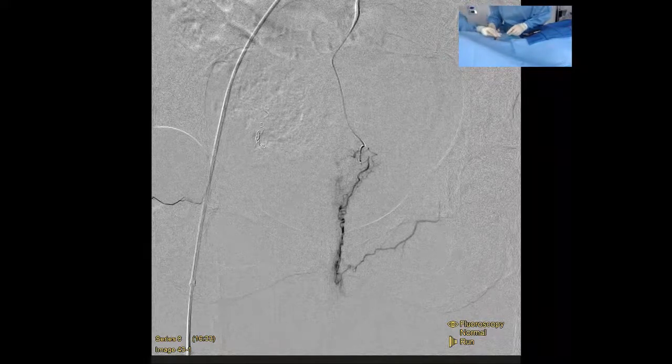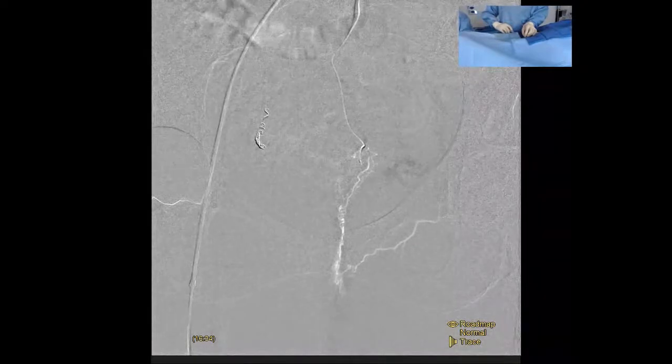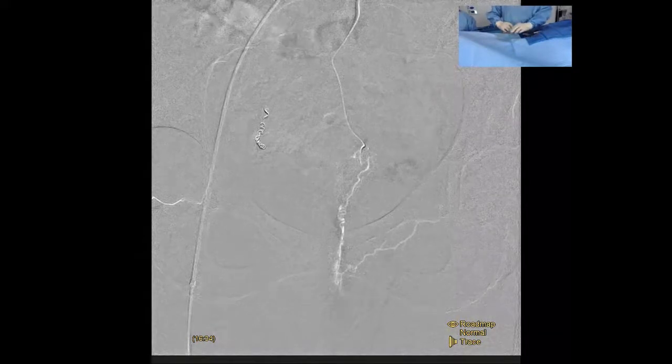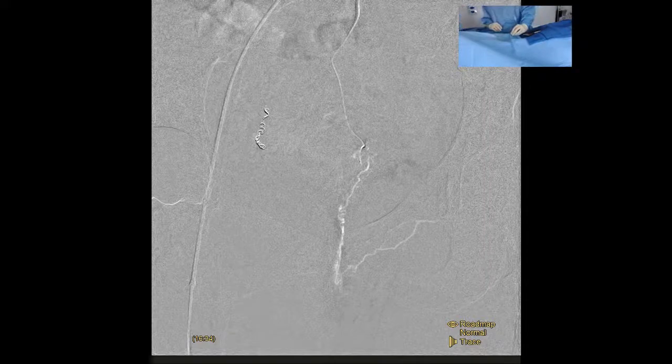And like I mentioned earlier, we're just really getting a little bit in here. Flush these through. It's interesting, coming from a place where we've done a lot of prostates, we always see these branches, the middle rectal and the inferior rectal, all the time on our runs, and we just think very little of them. Because it's prostate, you don't care about it unless it's in your way and it's going to be an anastomosis. But now these are big players in the hemorrhoid. Yeah, you're exactly right.